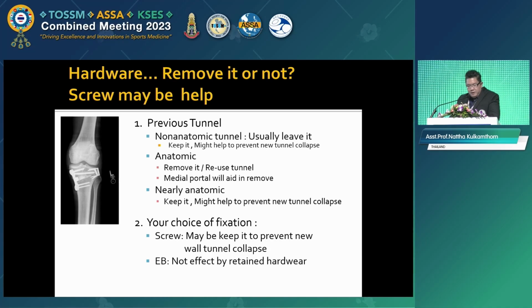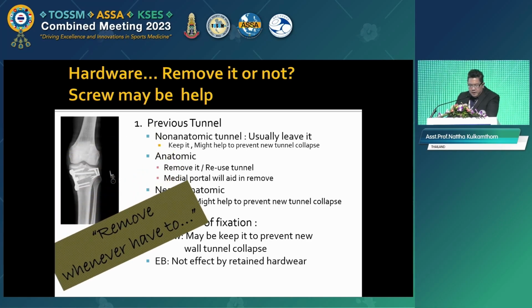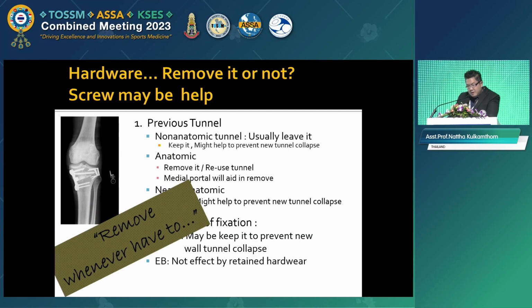It depends. Usually I keep the hardware and make a new tunnel. If the metal blocks your tunnel, I just remove that. So at first, for the metal, we keep that before I make the tunnel. So the conclusion is: remove whenever you need to remove.